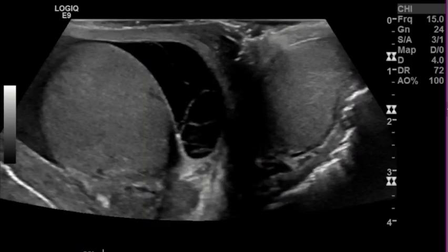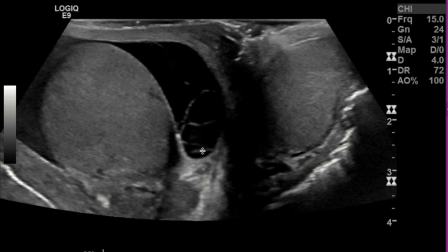Today I want to go over a case of a patient that presented to our emergency department with right testicular pain. Right off the bat, we can see that there's some sort of fluid collection here around the right testicle with these septations.